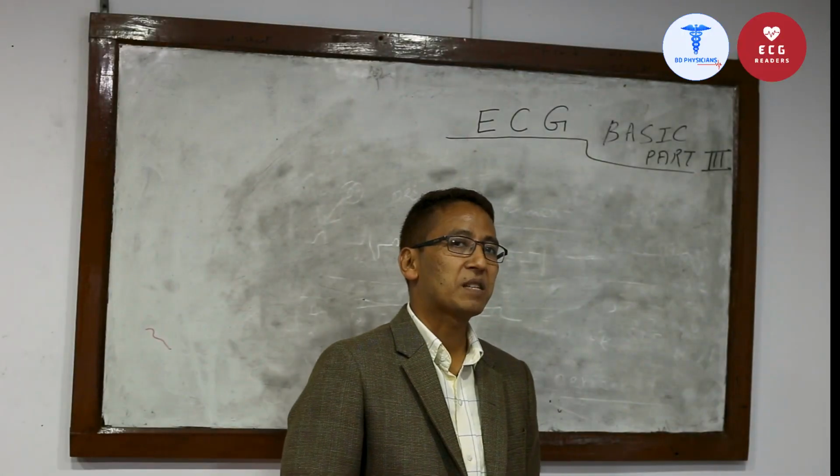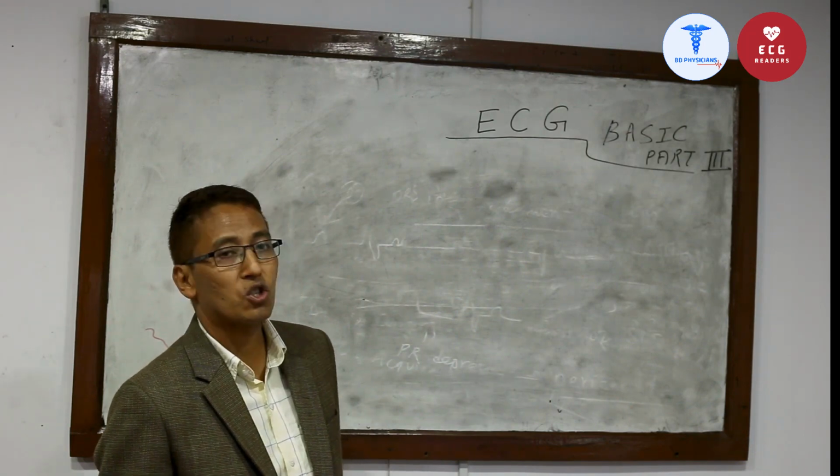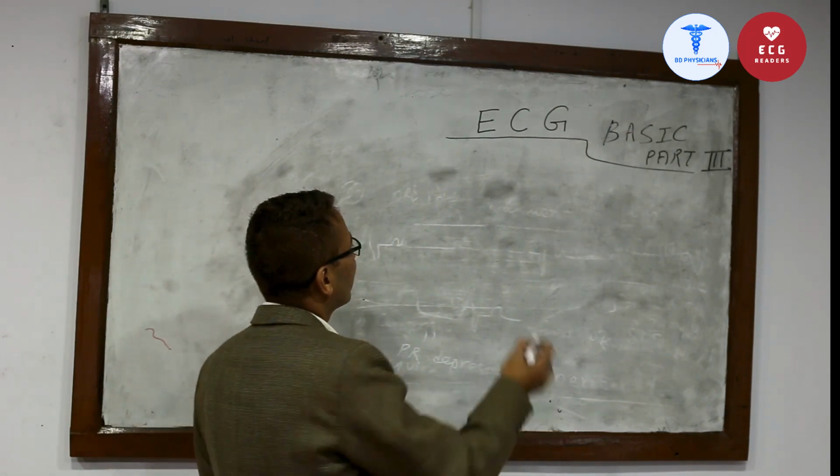Welcome to ECG Basic Part 3. Here today in this Part 3 we'll talk about QRS complex.